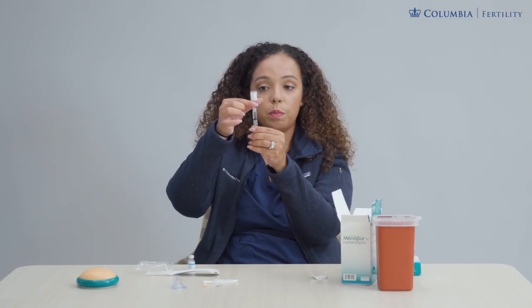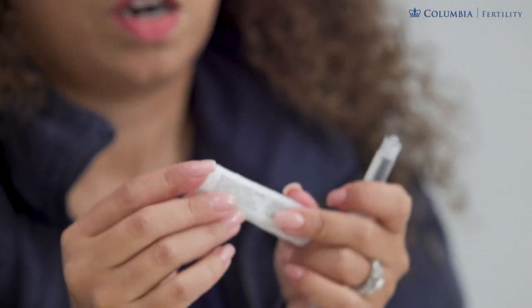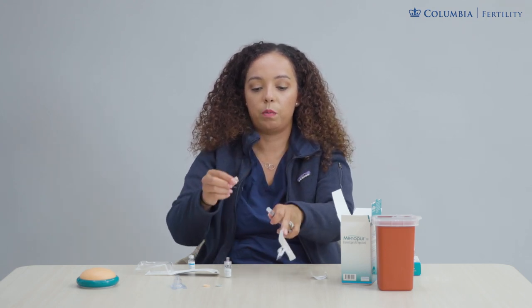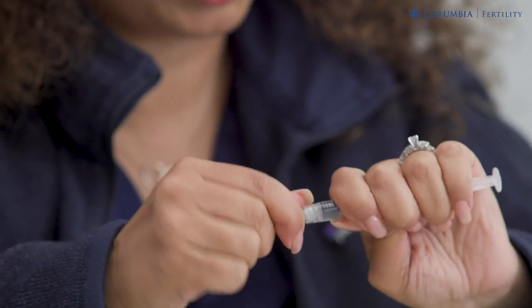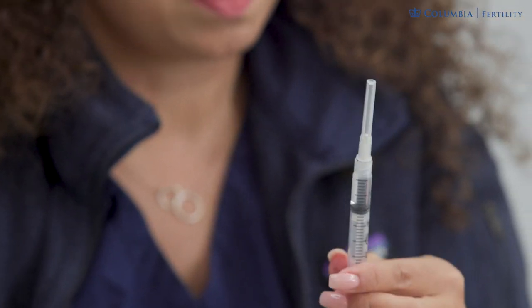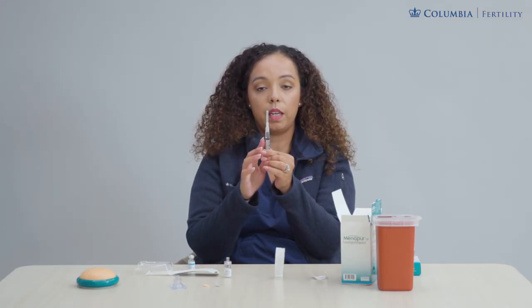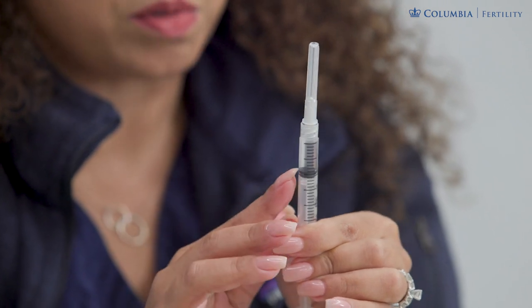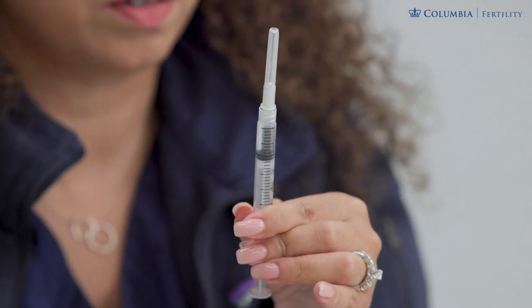Remove the Q-cap and the empty powder vial from your syringe and put on your tiny needle. Open up the tiny needle and attach it onto your syringe by screwing it on like a screw, making sure your connections are nice and secure. Before injecting, you must remove all air bubbles from your syringe. Flick your syringe so any air bubbles rise to the top, then push the plunger very lightly until you see the first drop come out of the needle.